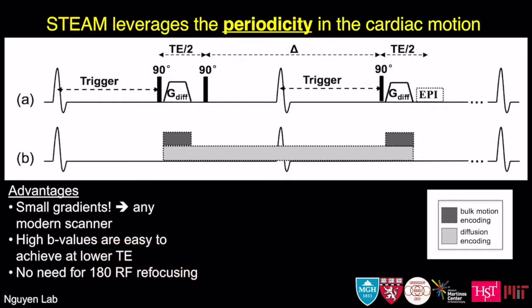And so the first set of imaging that they've done is the stimulated echo. It had some very nice features to it. It's a genius idea. It came out of here, of course, with MGH, with Bob Edelman when he was here, and with Van Wedeen, who all started it off. You didn't know he did cardiac diffusion too, right?